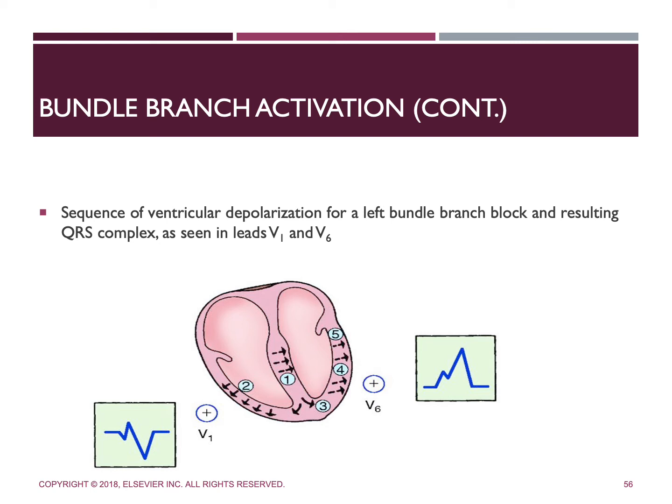So sometimes depolarization of the left ventricle will overshadow that of the right ventricle on the ECG. And when this occurs, a QS deflection is going to be inscribed in lead V1. And the small upright notch that is usually seen with right ventricular depolarization is going to be absent.